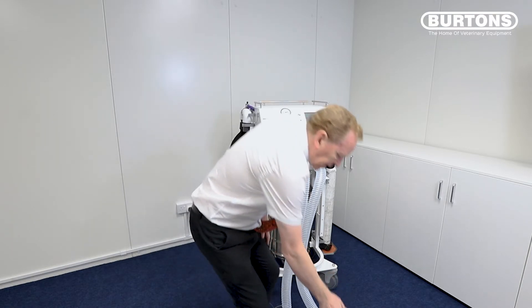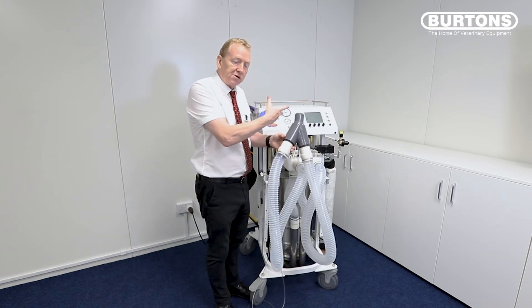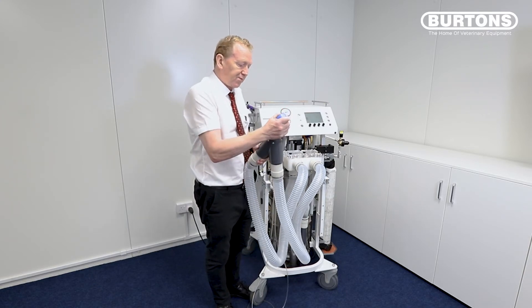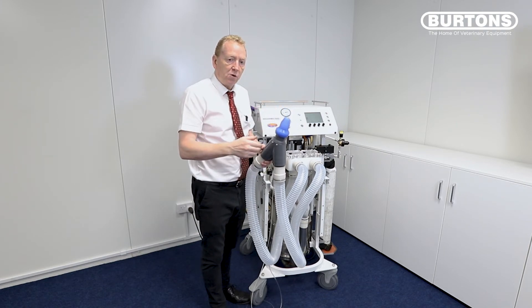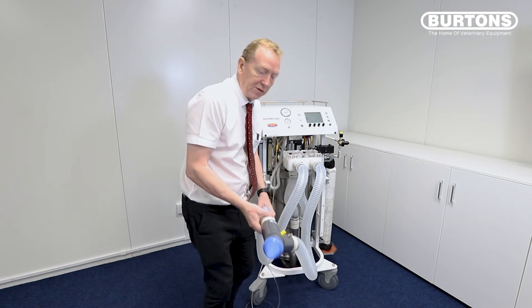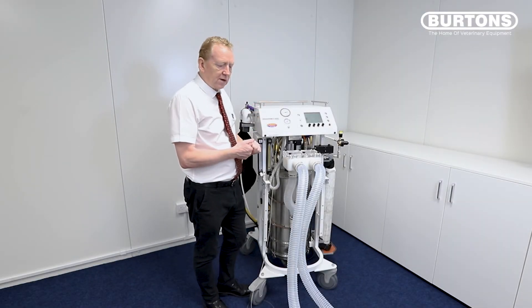One of the nice things to know about the system is that because it's a servo system based on pressure, there's absolutely no problem leaving it like this — there's no pressure in there and the gas isn't going to escape. It's just going to sit there waiting for connection. Whether the stopper's on or not doesn't matter. When my horse comes along I'll just disconnect the stopper, connect to the horse, and the animal will be able to breathe spontaneously immediately or we can go straight into ventilation.